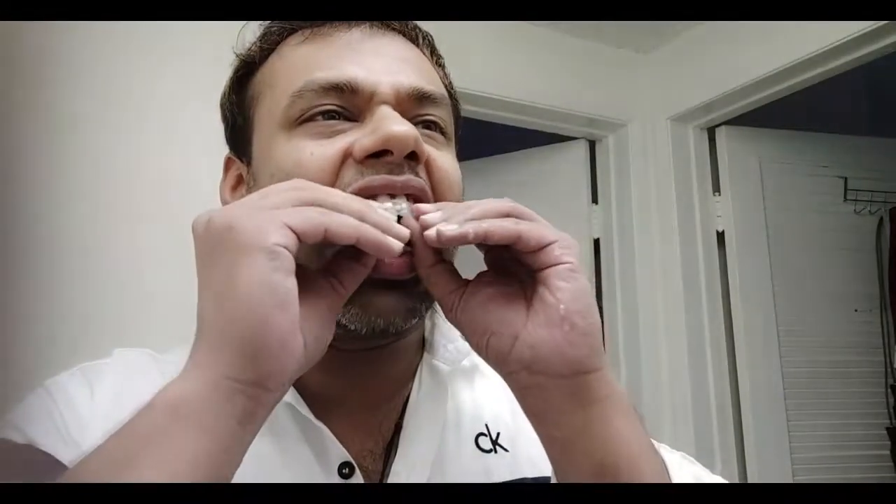Here you can see how the lower jaw looks after fixing the invisible braces. It's hurting a lot — in my honest opinion, getting a hair transplant is easier than aligning your teeth. For the upper jaw, I had to push really hard. I was trying for five or six minutes and the teeth were in a lot of pain. Finally, with a little hard pressure, the top brace automatically fell into place.